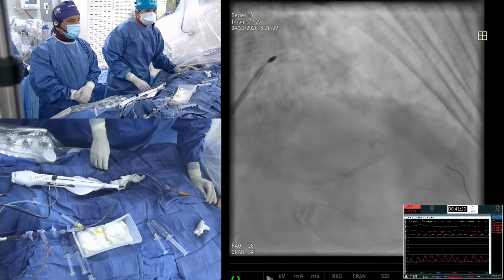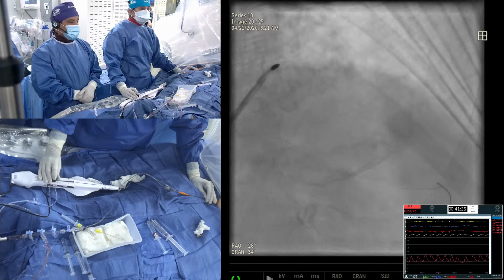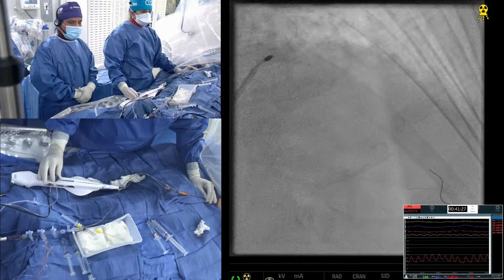Yeah, but there is calcium there. It's on one side only. It's moderate, I think we can leave it. Proximal was severe. But let's try to bring one back more. Otherwise, it comes out.